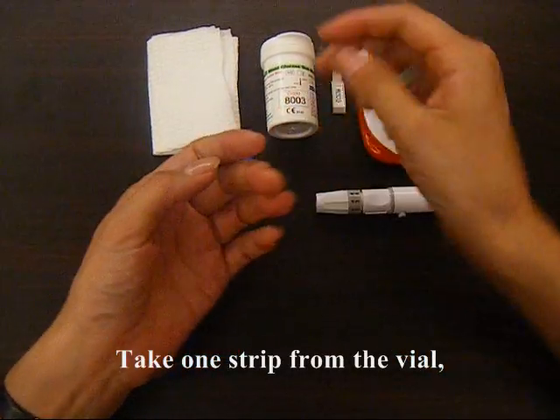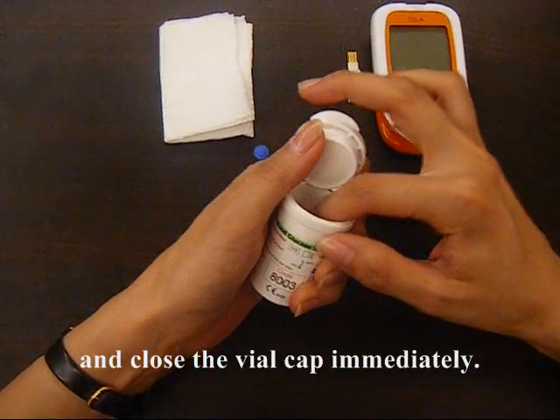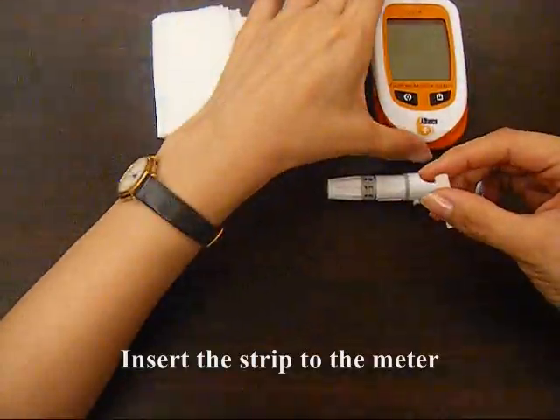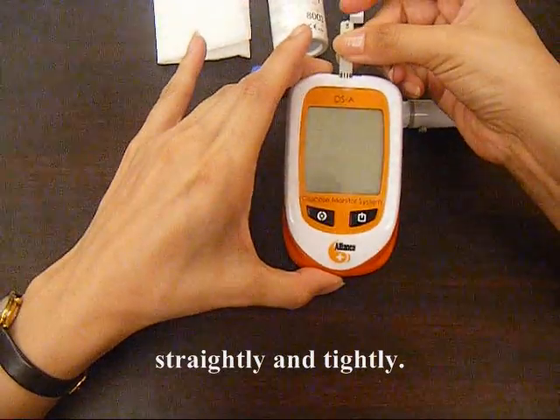Take one strip from the vial and close the vial cap immediately. Insert the strip to the meter straightly and tightly.